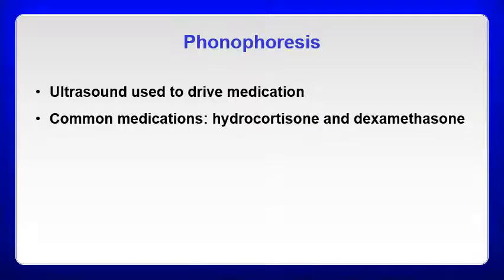The most common medications are both hydrocortisone and dexamethasone. Both of them are anti-inflammatory. The idea is that you would take the appropriately prepared forms of these and mix them with the conductive medium. Interestingly enough, there's little evidence to support the use of phonophoresis in clinical practice. There still needs to be more research on this. One of the contradictions about ultrasound is that it's pro-inflammatory, and trying to drive an anti-inflammatory seems counterproductive. That's one of the theories behind it. But for phonophoresis, there's just not a lot of really good evidence.